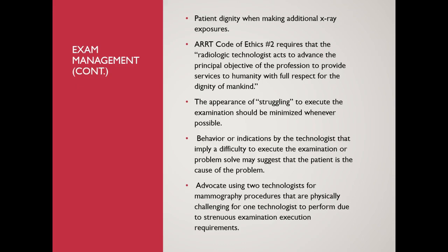We also have to keep in mind that the patient needs to be respected when we're making additional X-ray exposures. They do have dignity that we need to respect. The ARRT Code of Ethics number 2 requires that the rad tech acts to advance the principal objective of the profession to provide services to humanity with full respect for the dignity of mankind.